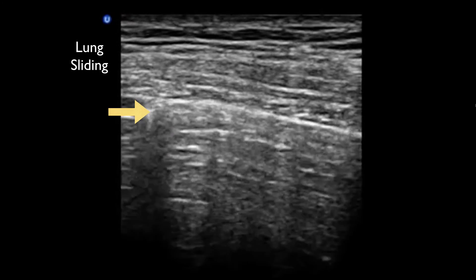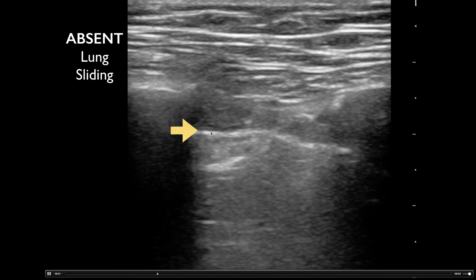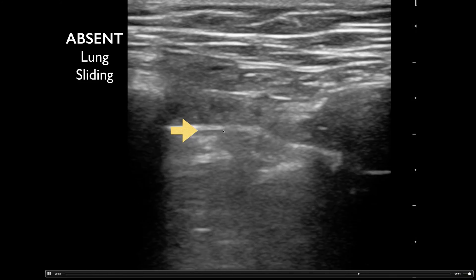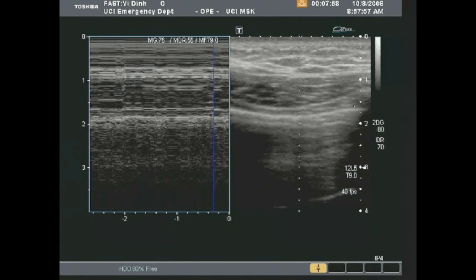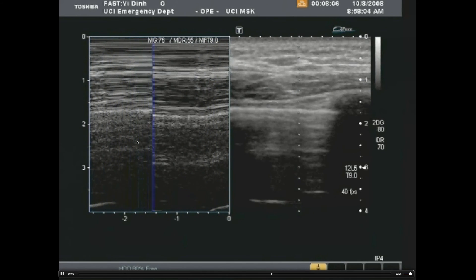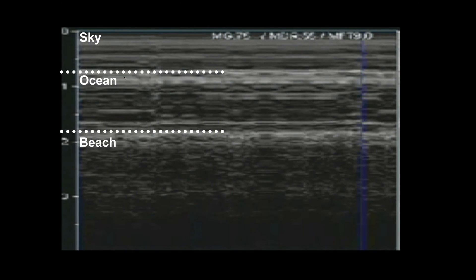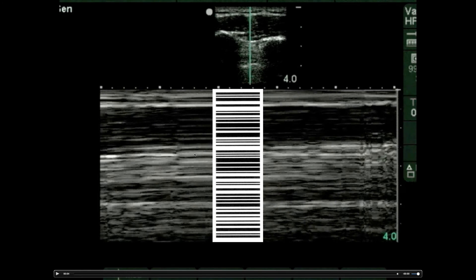Seeing lung sliding absolutely rules out pneumothorax in that area. If you don't see lung sliding — only parietal pleura with no visceral pleura adjacent — that's concerning for pneumothorax. You can also use M-mode: place the cursor across the pleural line and look for the seashore sign, which shows a sandy beach appearance below the pleural line indicating lung sliding. Without lung sliding, you'll see the barcode sign — no sandy appearance past the pleural line.